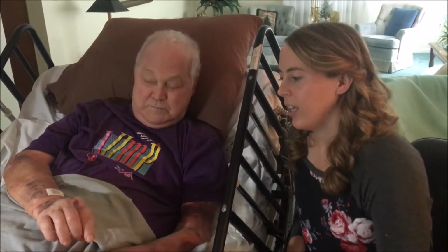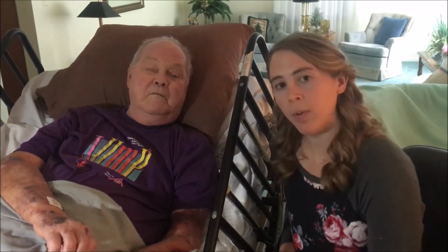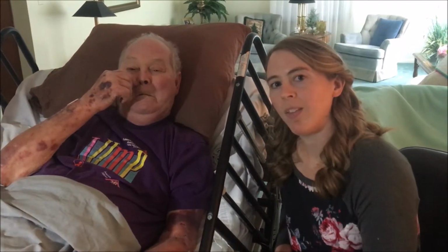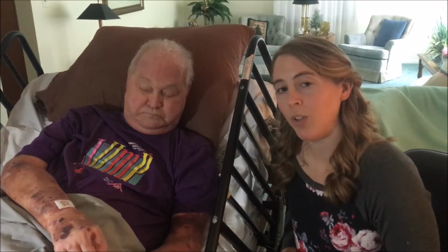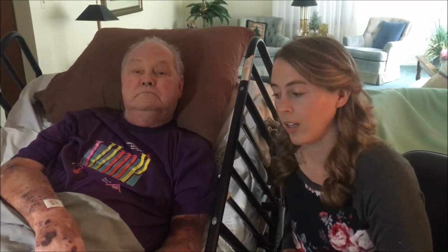So Grandpa here has an extensive medical history. He was diagnosed with type 2 diabetes and had open heart surgery. He also just recently got diagnosed with a tumor near his brainstem, and so that's what puts him on hospice today. He has not been diagnosed with neuropathy, but with the monofilament assessment, we're going to hopefully screen and see if any of his conditions could be contributing to superficial sensation pathology.